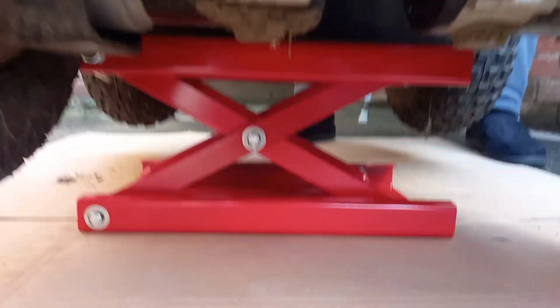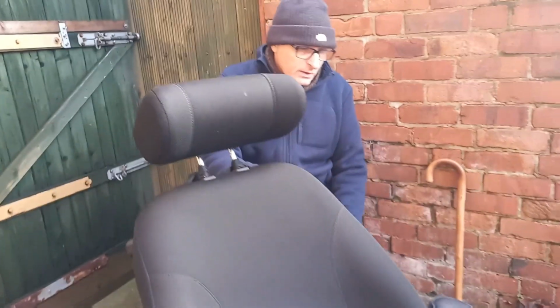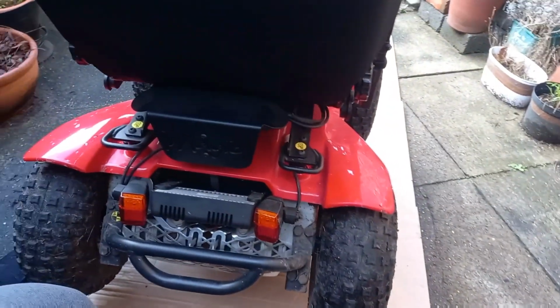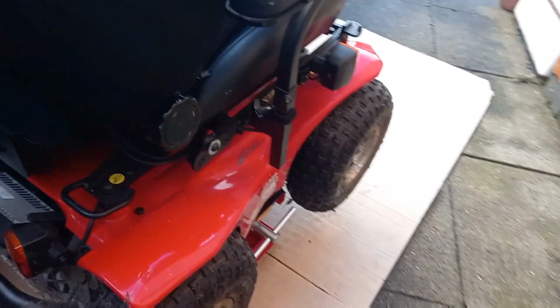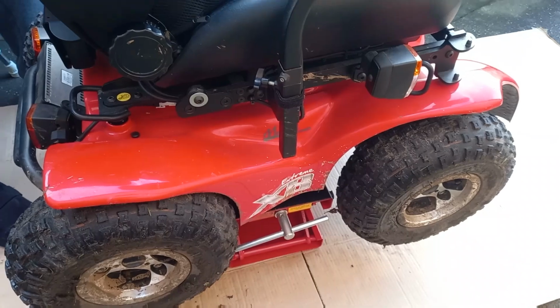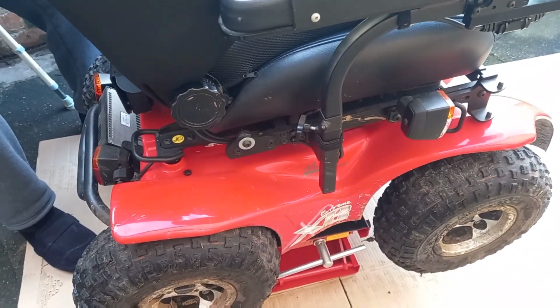Yeah, we wanted it central on the battery box, but you can see it just isn't. But it doesn't try and rock sideways, which tells me that it isn't going to be. I mean, I can't make it tip left. No. Which means it wouldn't be any different. But it's just that bit higher for you to not have to. Yeah, I should be able to. I can get to the fasteners now, you see. So I mean, it will go higher, won't it? Oh yeah. Do you want it any higher? I think we might take it a little bit higher.